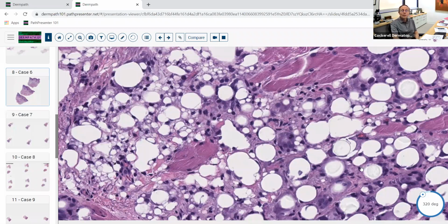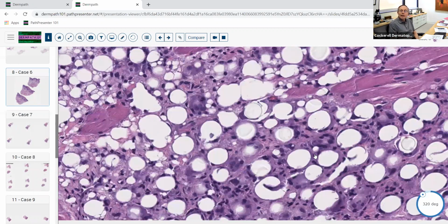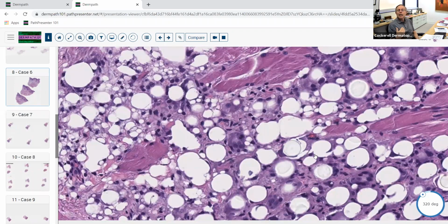There's also a couple of other things over here too. Notice that there are these small little BBs in the skin. So these are probably fillers, I would imagine. And patients that get filler injections want to look pretty, so they're getting all sorts of stuff. They may get autologous fat injections. They may get hyaluronic acid. They may get methyl methacrylate injections in their skin, Juvederm, Radiesse. They may get all sorts of things injected. So this is not methyl methacrylate. This is silicone over here. These small little tiny bubbles would be silicone.